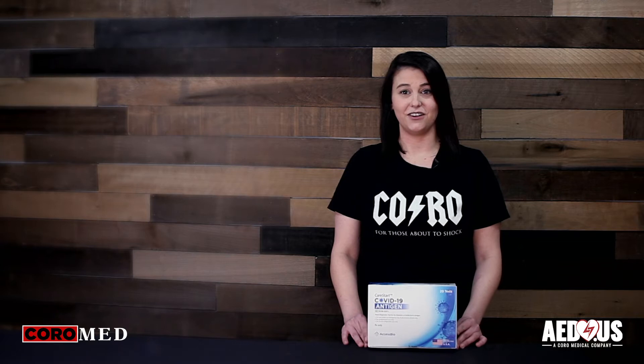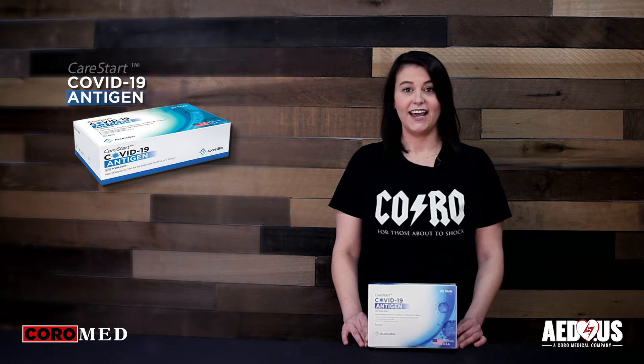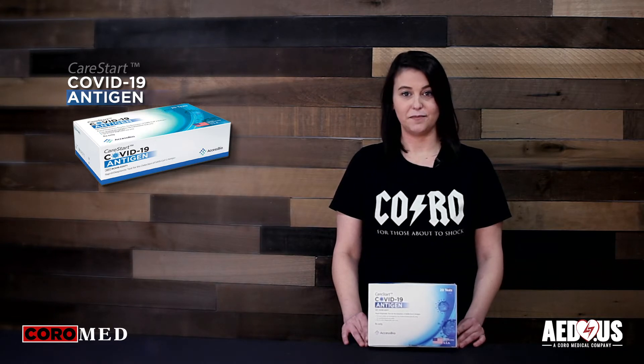This is Jenna with Coro Medical, home of AED.us, and today we're going to demonstrate how to administer the CareStart COVID-19 Antigen Rapid POC test by AccessBio.